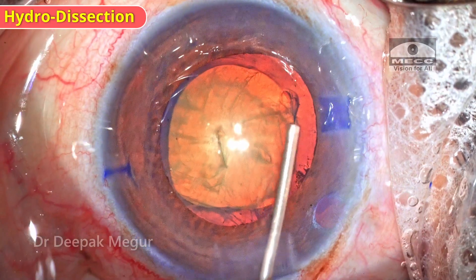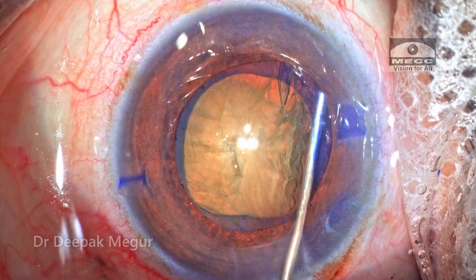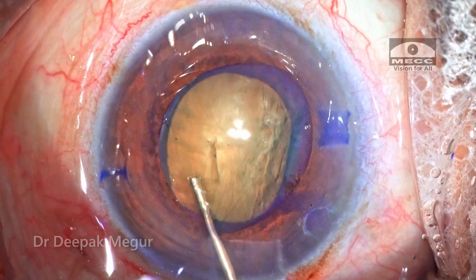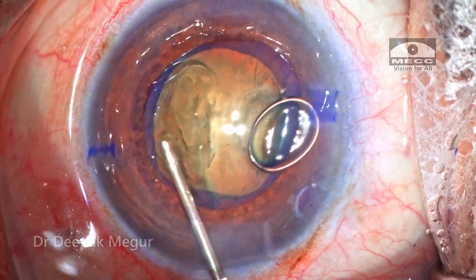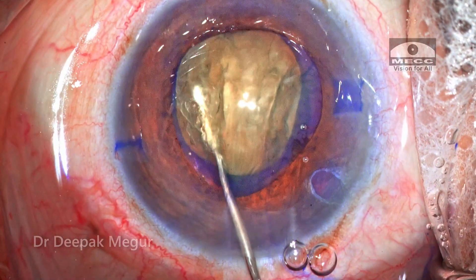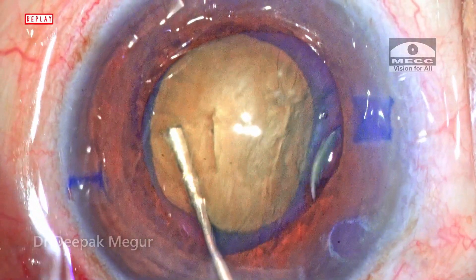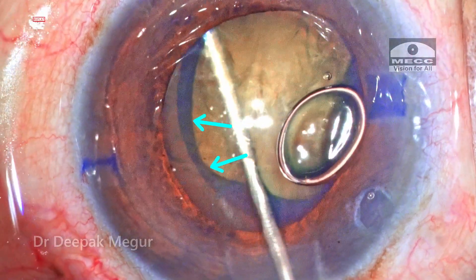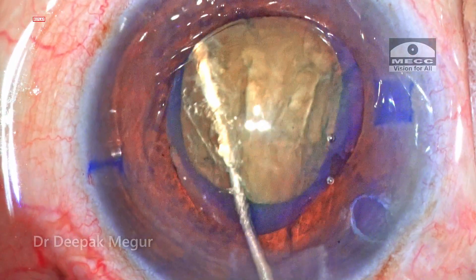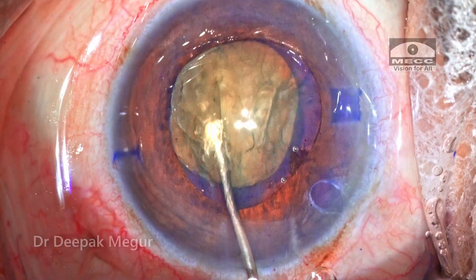Cortical cleaving hydrodissection is one of the most important steps in eyes with zonular weakness. As I do it, I'm unable to clearly see the fluid wave. I go ahead and decompress the bag by pushing down on the nucleus at the opposite side. As I try to nudge the nucleus, I can see that the bag is also moving along with the nucleus-cortex complex, indicating that the cortical fibers are still not totally free from attachment to the capsular bag.